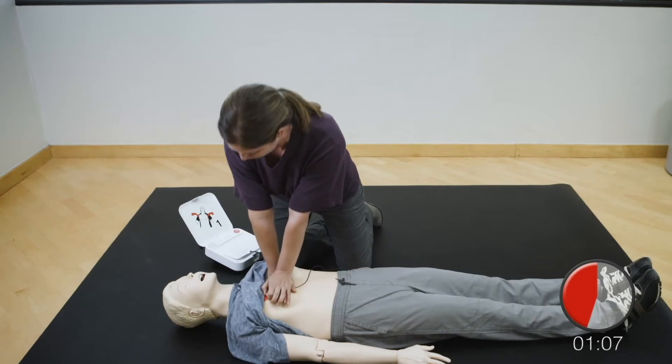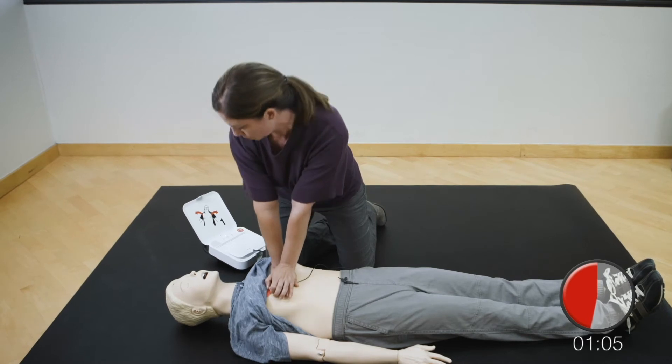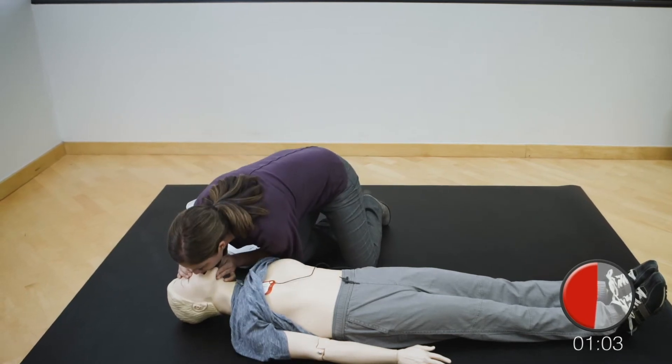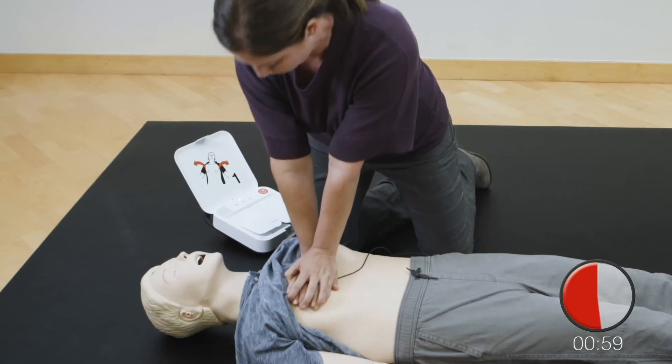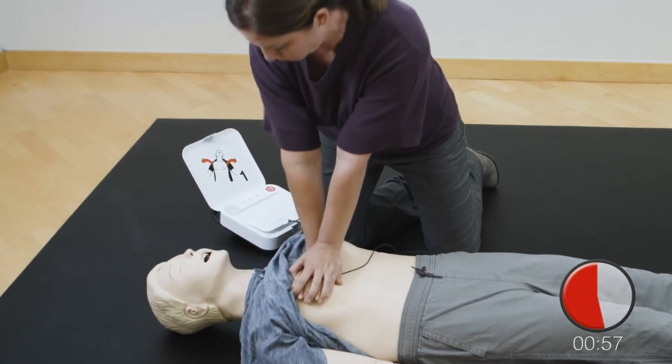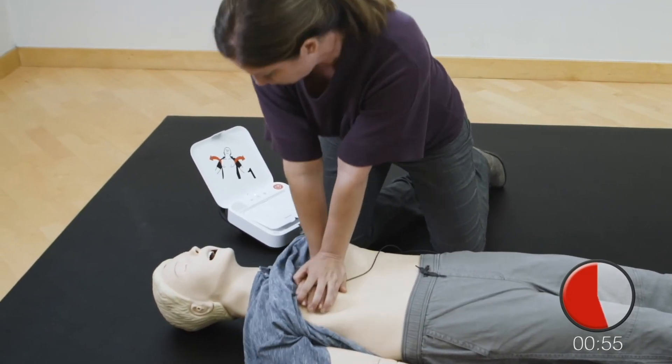Provide two breaths. One. Two. Resume chest compressions. Push down hard at least two inches.